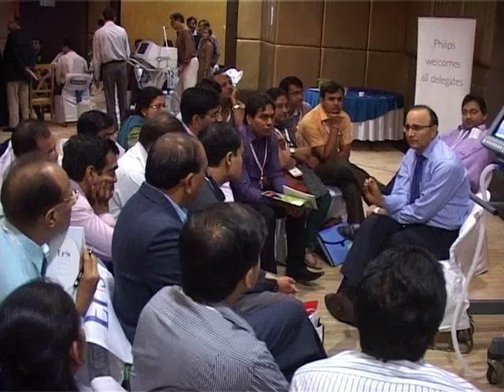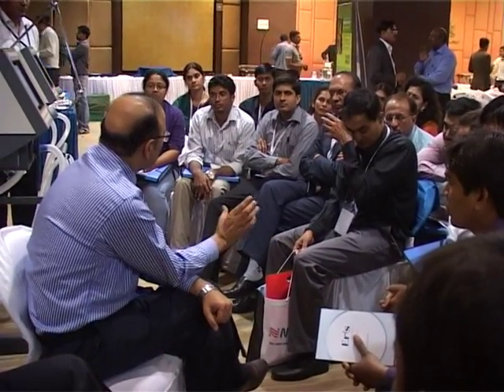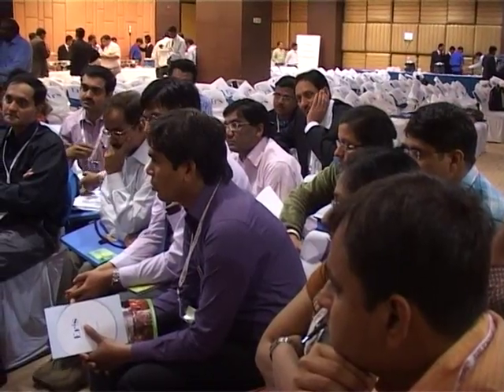But the ventilator, as I told you earlier, is not a treatment by itself. If you are not a good clinician, the ventilator really can't do much for the patient. It helps you to buy time so that as you address the condition which resulted in respiratory failure, you can take care of it. Okay? So these are the basic things about ventilation. When you have to start ventilation, when they discuss setting of a ventilator, they discuss the details, but I will discuss with you the basic concept.